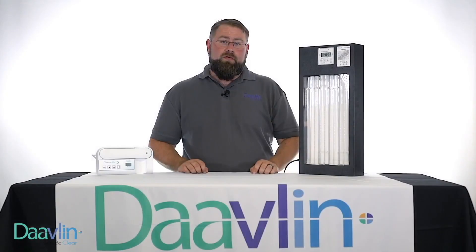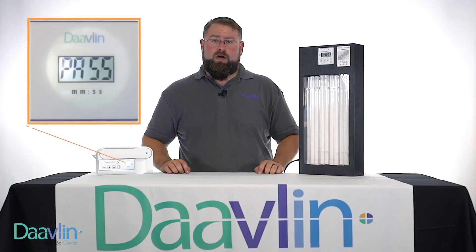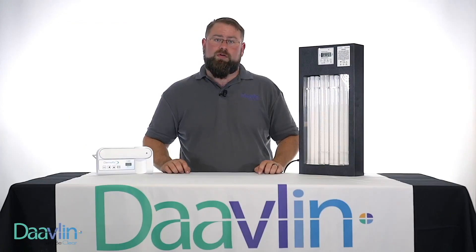Your Davlin unit was prescribed with FlexRx. This feature allows your prescriber to track the number of treatments, allowing them to follow up on your progress. When your device says "pass," it simply means that you've used all of your treatments.